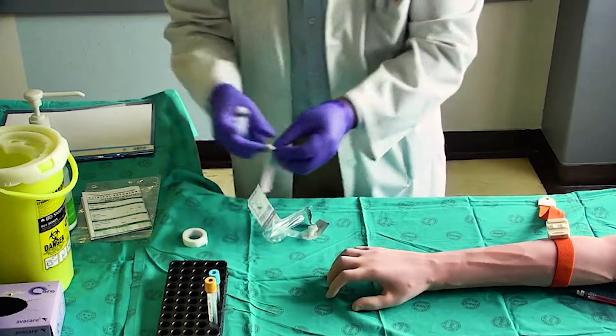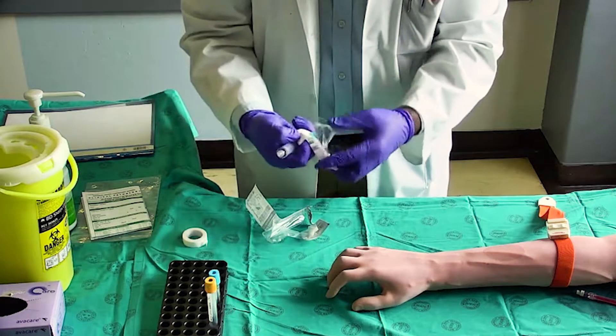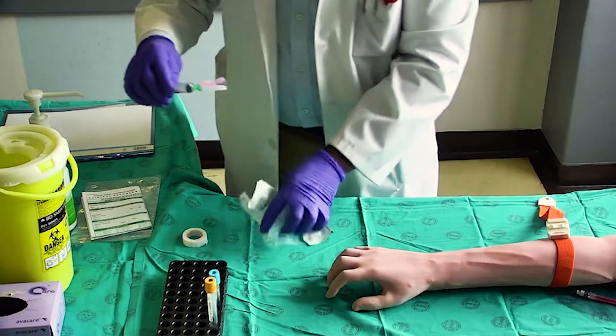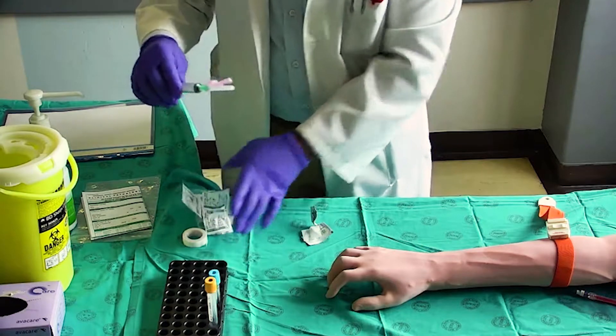Assemble the safety needle and syringe. Remove the safety needle cap.